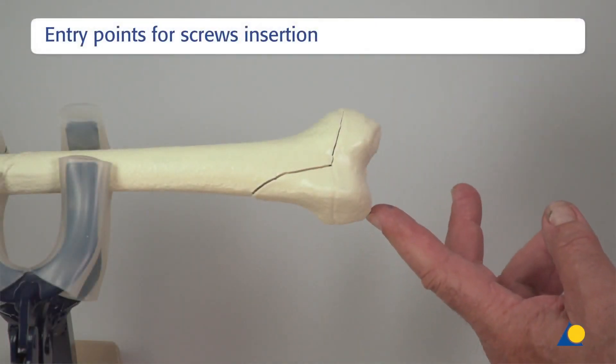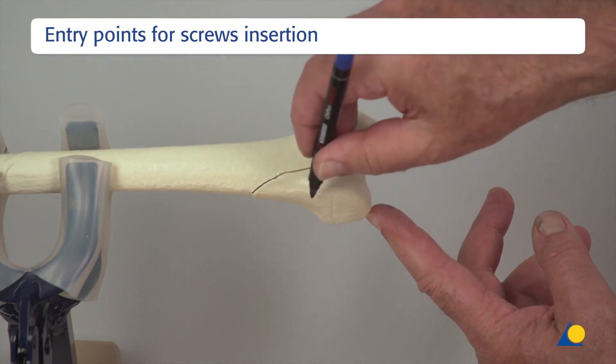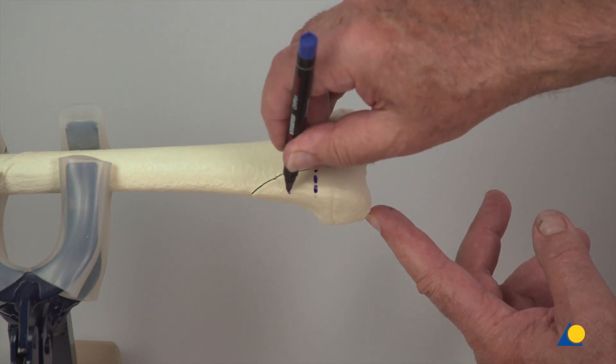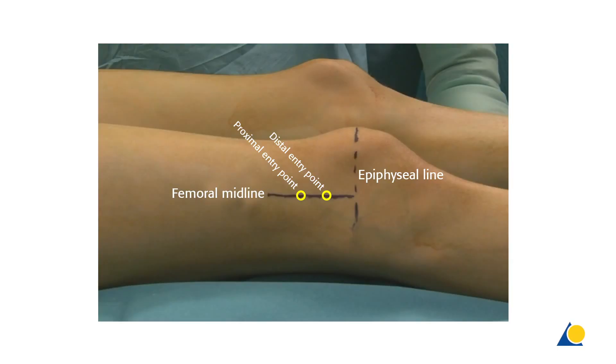The entry points are marked on the anterior side across the metaphyseal segment, and on the lateral side matching the central line of the shaft. The entry points marked in yellow are in the midline of the femoral shaft and not on the central line of the condyle.